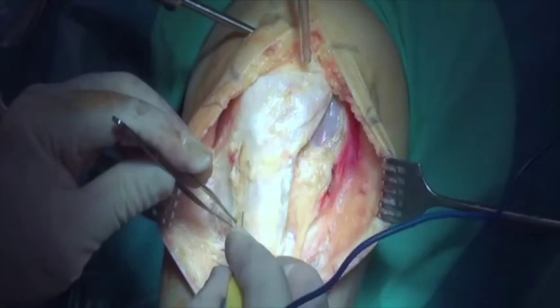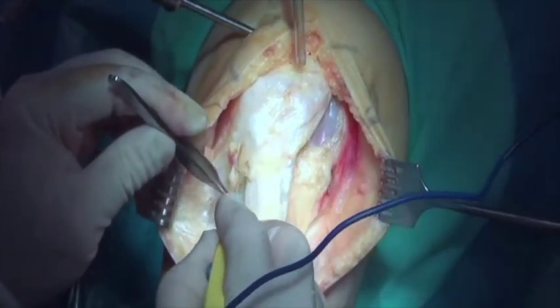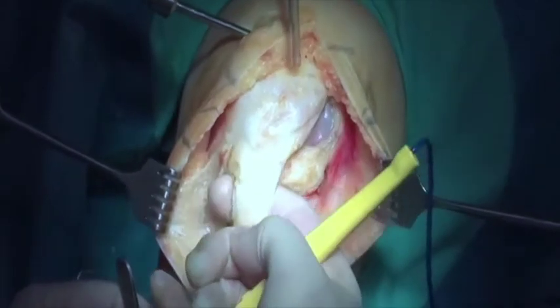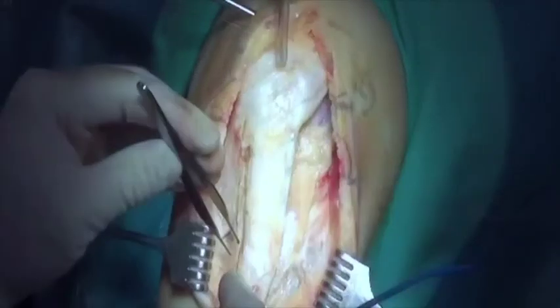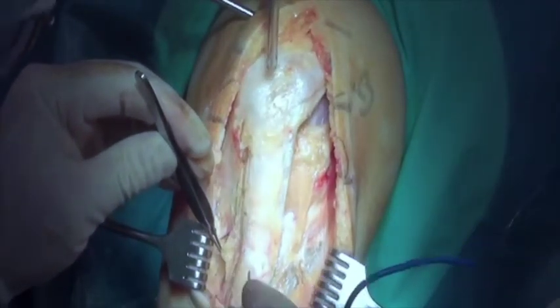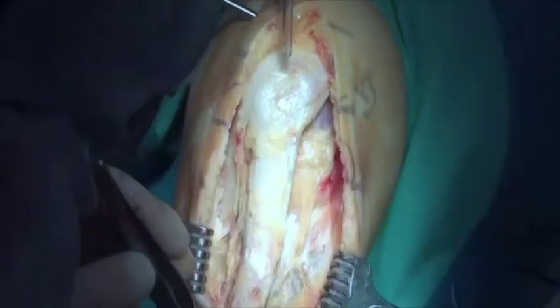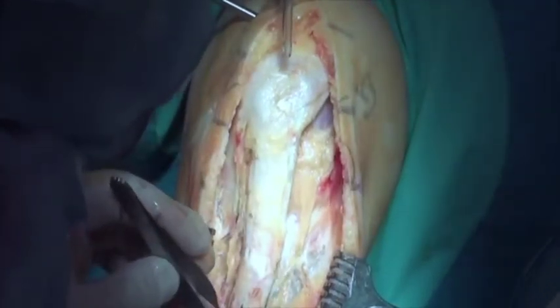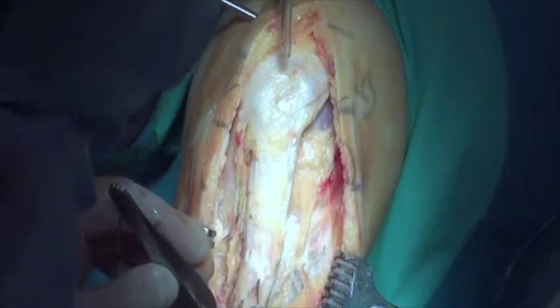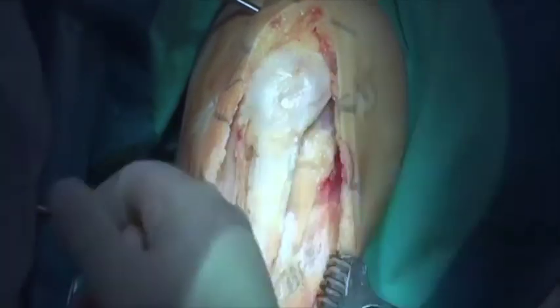Once the appropriate amount of correction is obtained, the medial side of the patellar tendon is identified and the tendon is freed from the underlying fat pad. Electrocautery is used to identify and mark the borders of the tibial tubercle, and also to mark the desired positions of the two screws used to secure the osteotomy.